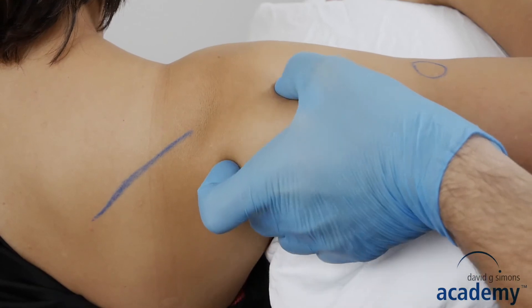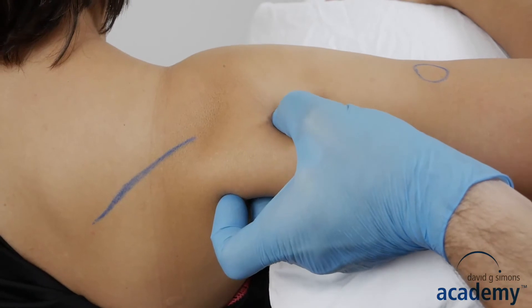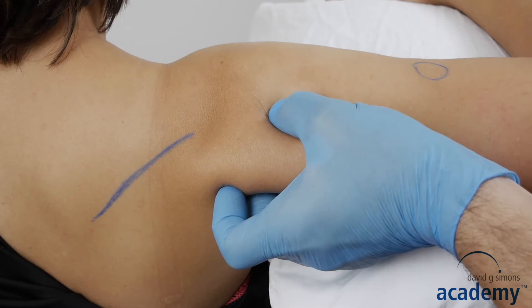With the pincer grip you can avoid injuring the joint and the radial nerve. To protect the axillary nerve and the vessels, avoid sharp and burning pain.